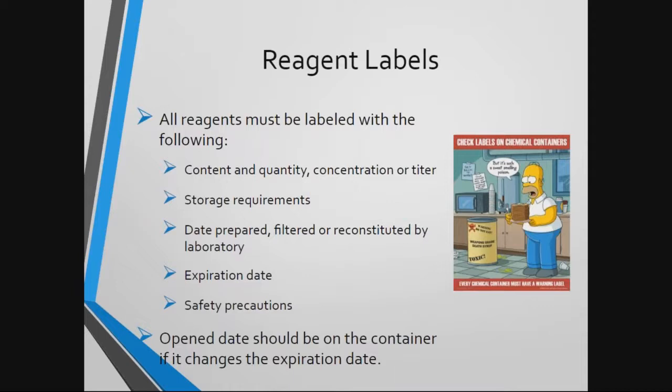As a point of review, all reagents must be labeled with the following components: content and quantity, and then also concentration or titer if applicable, any storage requirements, the date it was prepared, filtered, or reconstituted by the laboratory, an expiration date, and then those safety precautions. An open date only needs to be indicated on the container if it changes the expiration date for the contents.